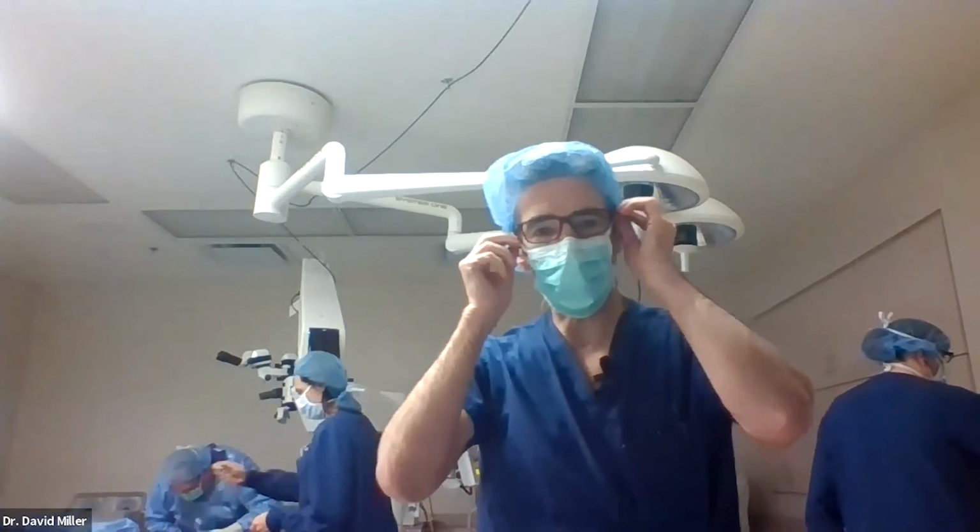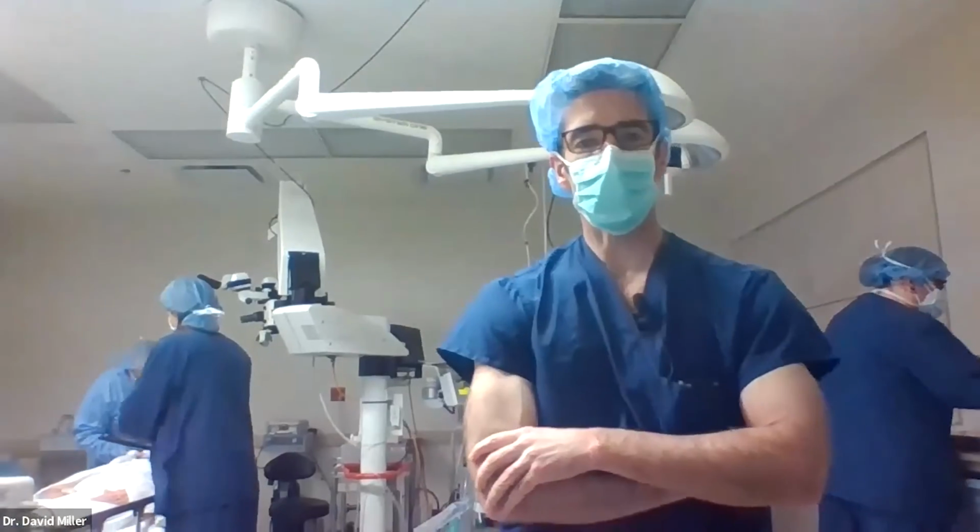So thank you everyone for attending. So glad we could show you these two cases, interesting cases both, always something to learn. The particular things in this case that are interesting is one, there was gas in the eye, but no cataract. Two was prior surgery, so some stiffness in the vitreous from prior, what I would call very early PVR, and the cellular vitreous are your clues there.